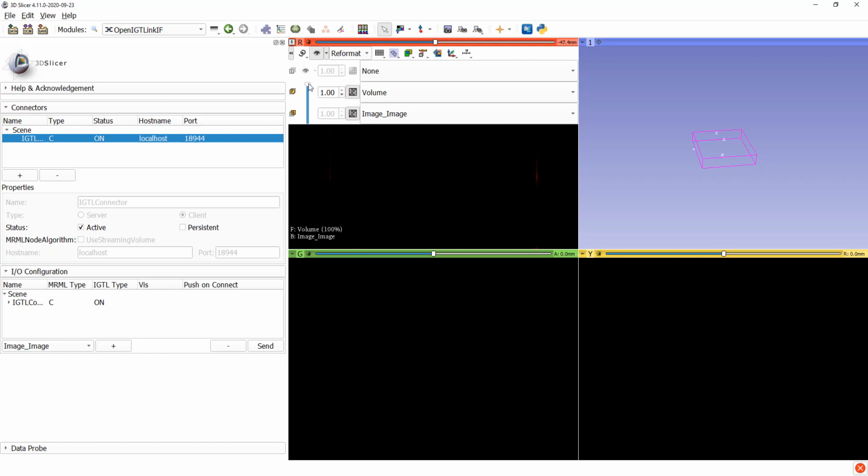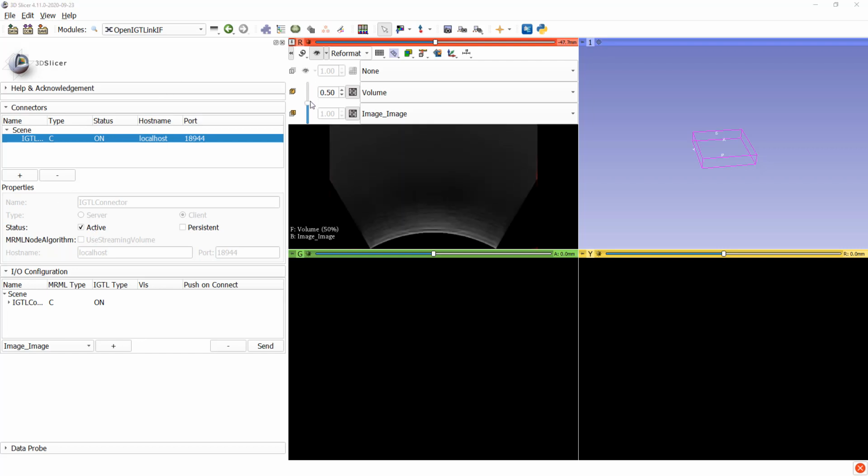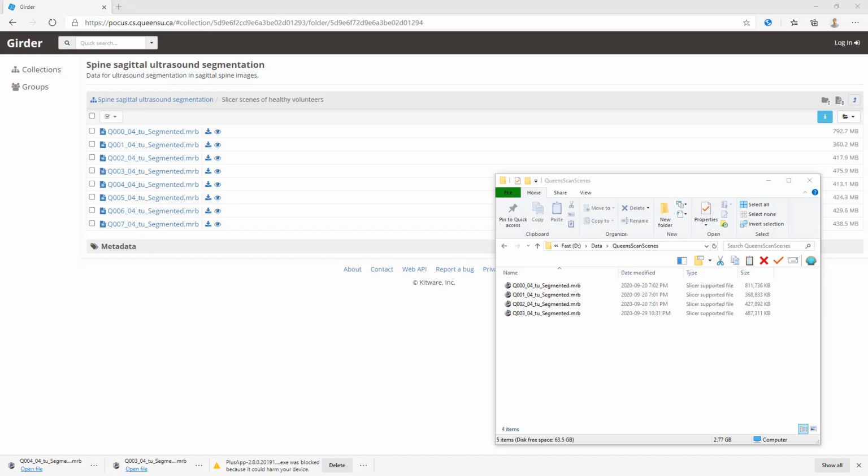And we can also blend the two images with different colors. So the prediction image here is from black to red, while the ultrasound image is from black to white. And again, I'm just scanning my arm here using the spine segmentation model just to see if it's working.